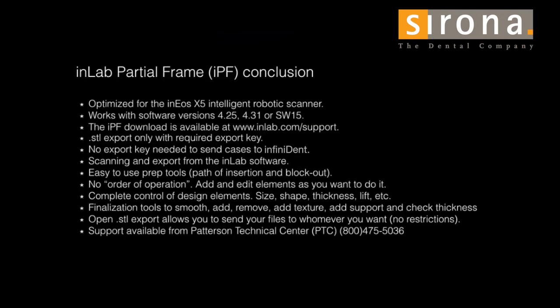So this is the end of the IPF webinar. And in conclusion, please keep in mind that the software is optimized for the INEOS X5 intelligent robotic scanner. It does work with inLab versions 4.25, 4.31, or software 15. The IPF download is available at inlab.com/support. You also need a license to do STL exports, but no export key is needed to send cases to Infinident.